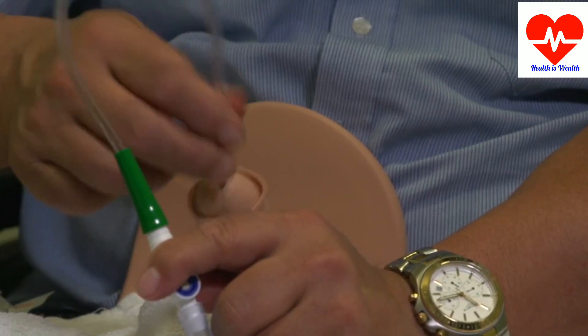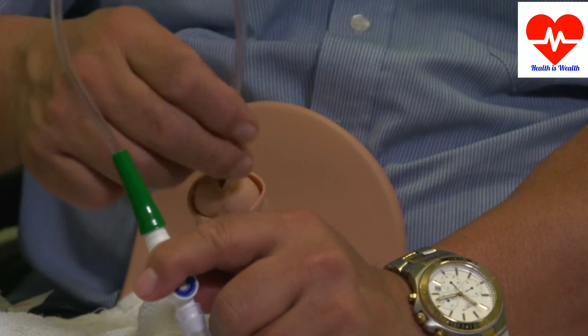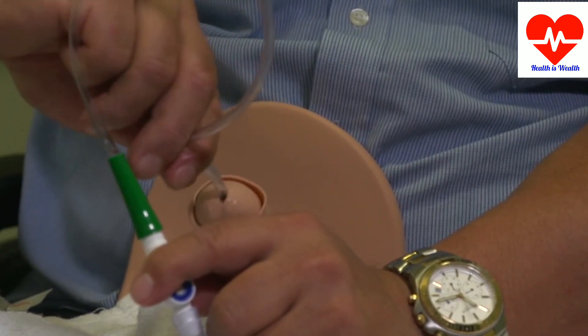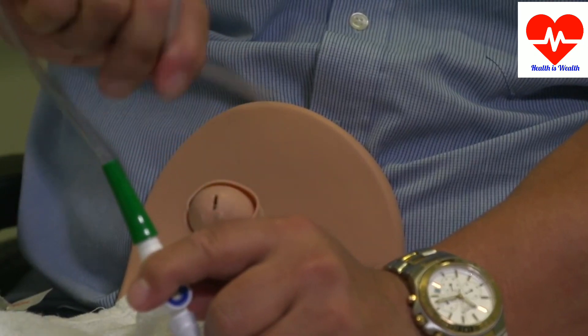Pull it all the way out and ensure that the tip of the catheter is pointing uphill, so it drains into the bag.